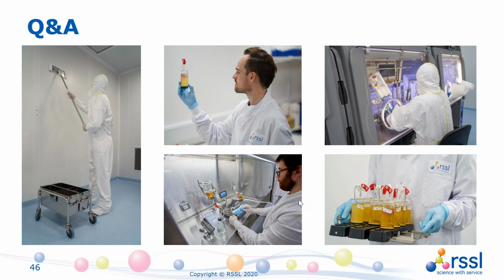Whether the contract test laboratory needs to include those or not would really come down to what is set to be covered in the technology transfer arrangement, because the degree of validation is going to be dependent upon whether the same test kits are used, whether exactly the same source and type of culture media, the rinse solutions, the techniques, and so on. So the belt and braces answer is yes, they would be included, but it doesn't necessarily need to be so, depending on what are the variables involved with the transfer and what you are seeking the contract test laboratory to replicate. So it's on a case-by-case basis, but obviously the zero risk option is to include the environmental isolates.